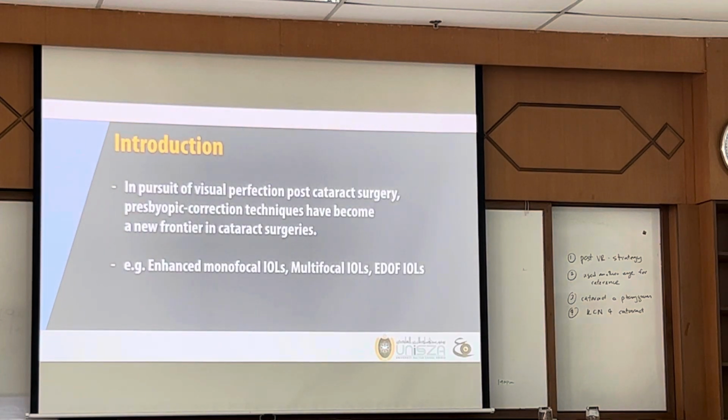So, in pursuit of visual perfection, post-cataract surgery, everyone now aims for 6/6 without astigmatism. So presbyopic correction techniques have become a new frontier in cataract surgery. For example, we have enhanced monofocal IOLs, multifocal IOLs, and EDOF IOLs.